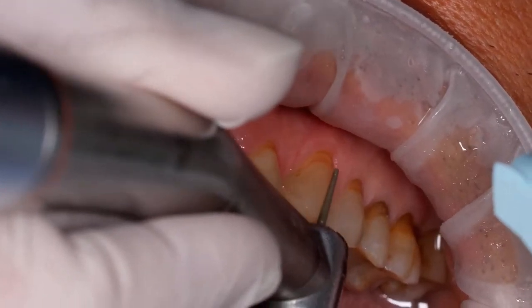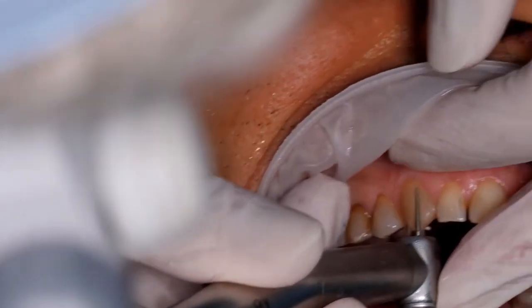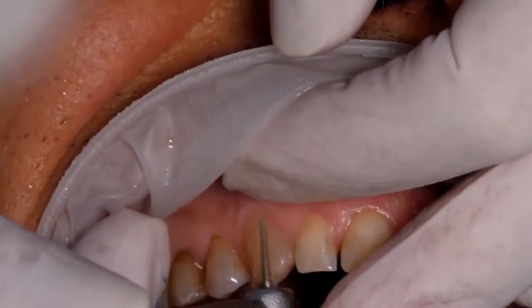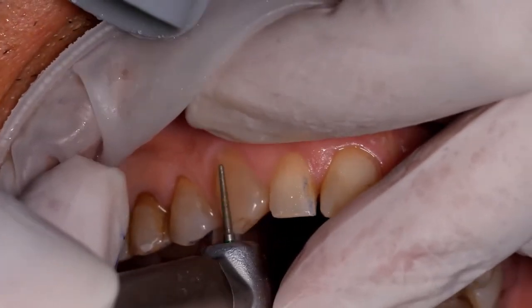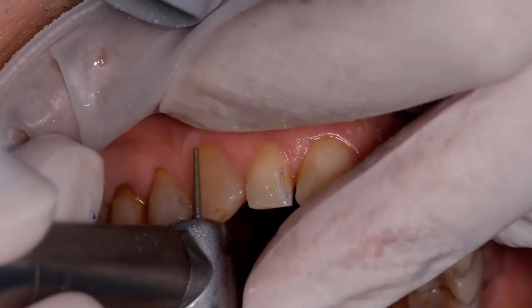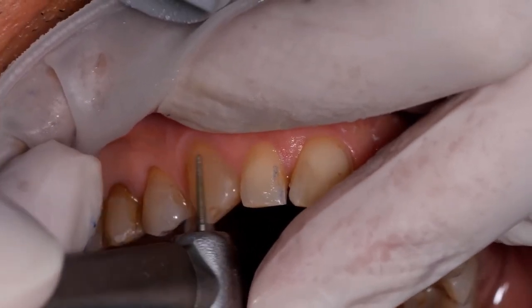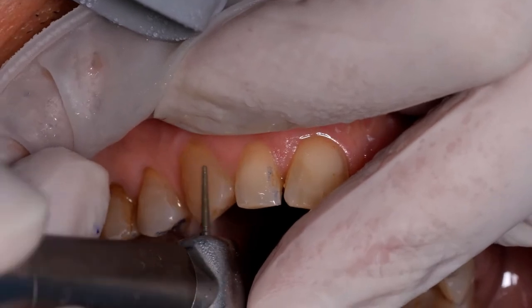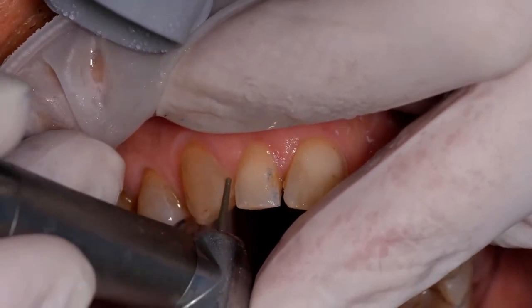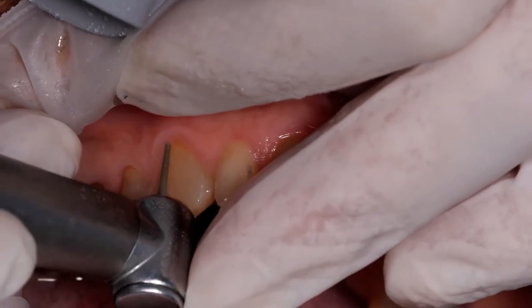Perfect, I'd say everything's fine now. Just another small touch-up here. Let's take a look at the other cuspid — we'll prepare the two cuspids first. Since the patient's thicknesses are already okay, I'll try to improve the cuspid orientation, since they were slightly rotated. That's why I'm preparing this central area to flatten out these areas and have more even thicknesses.